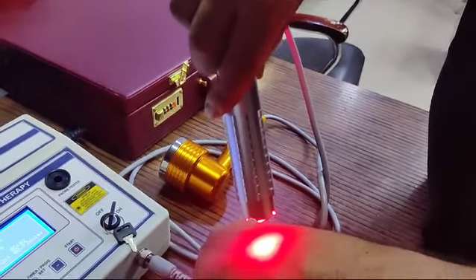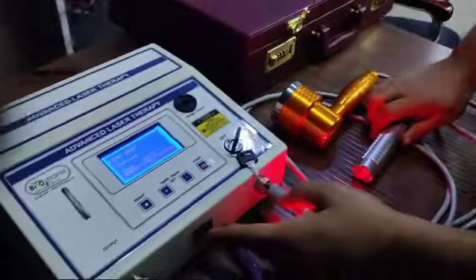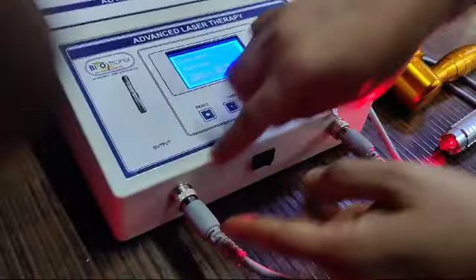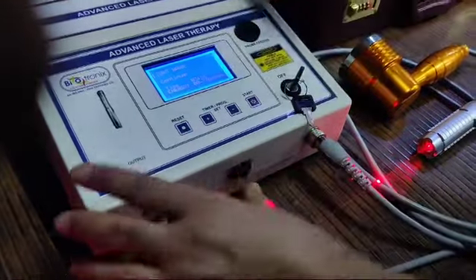This is the switch button to select the pointed probe and cluster probe. Currently it's on the side of the pointed probe. Now I am switching to the cluster probe.